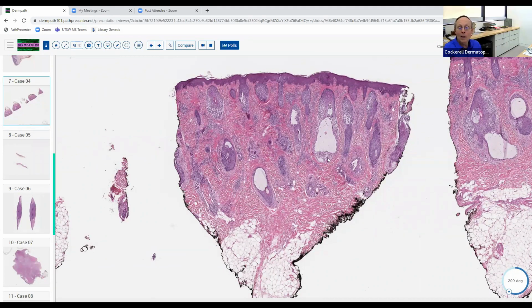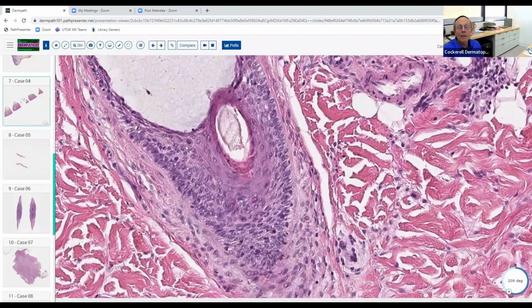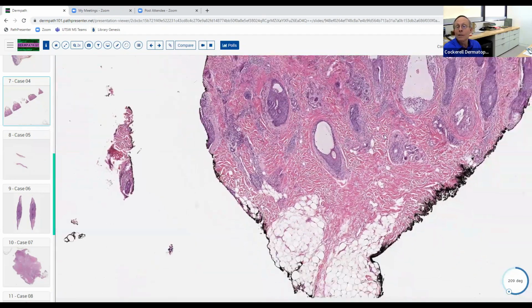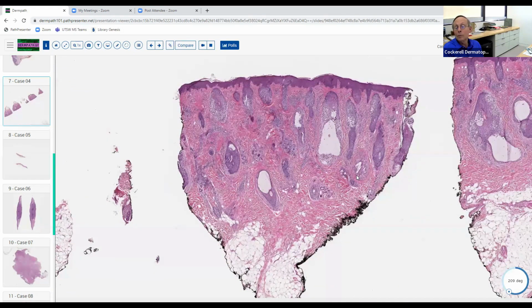It's called that because these follicles are shifted out of anagen, and this may be a catagen follicle here, possibly. In fact, it probably is catagen, early telogen, and then these others are probably little telogen follicles. So these are shifted out of anagen, and they have alopecia there, and so it's an interesting disease. I'm not sure we really know exactly why this happens, but they get the mucin, the inflammation, they get alopecia, and it's usually seen in young individuals.